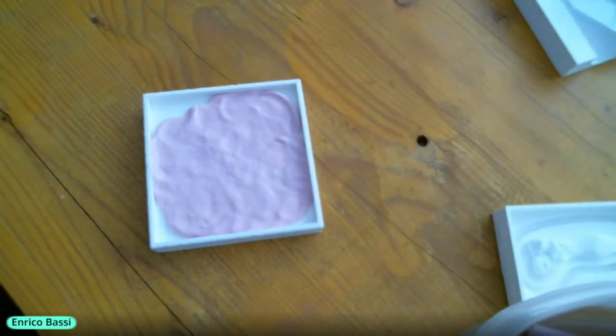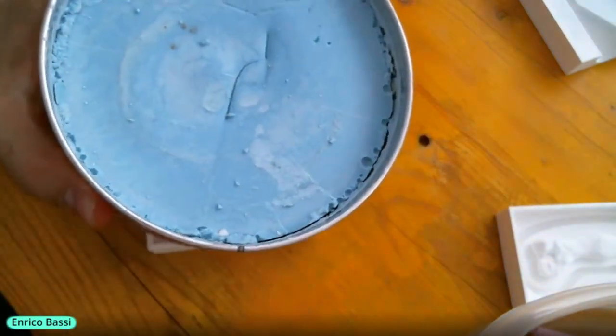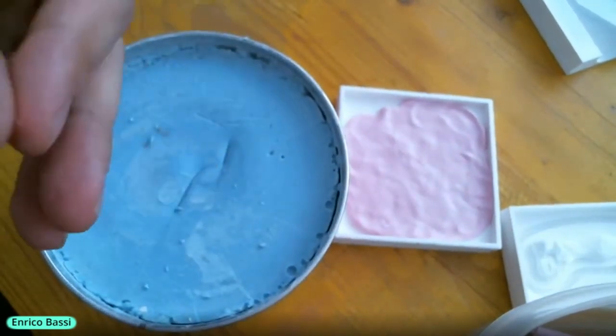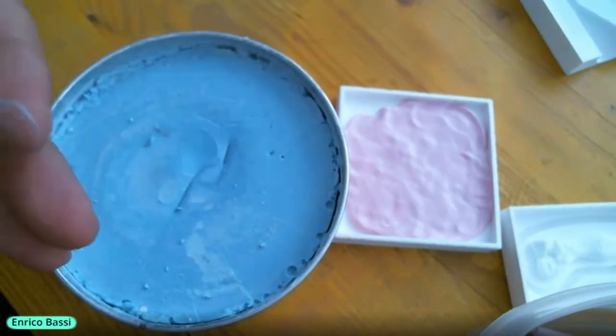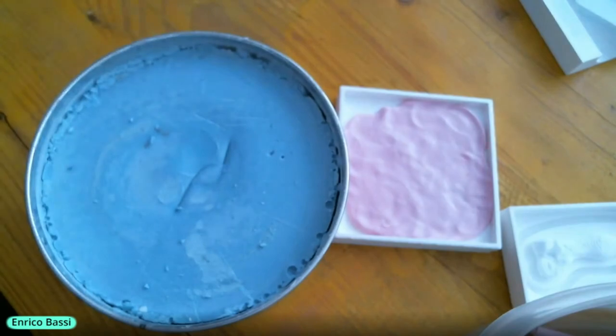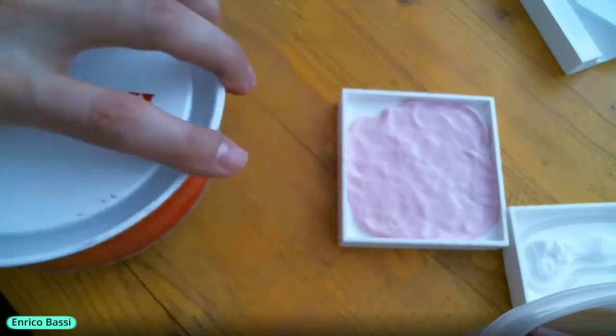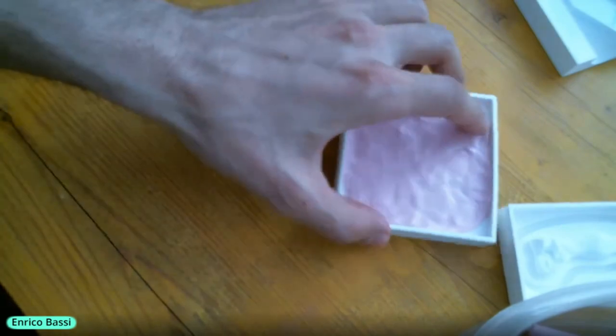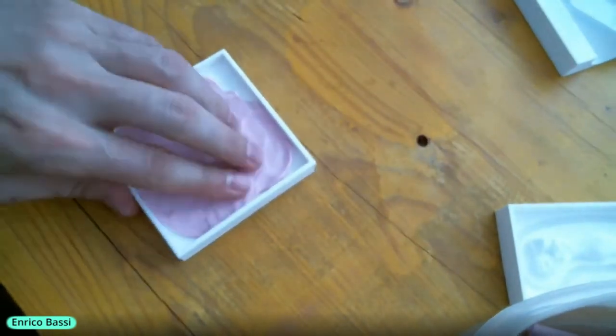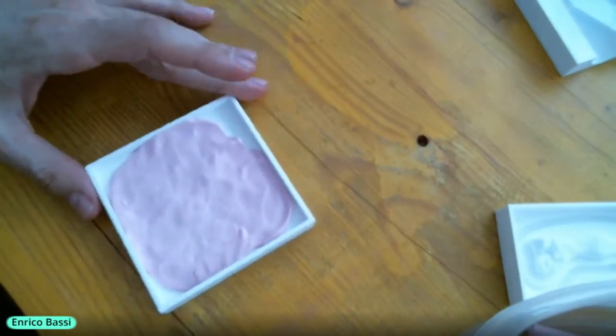It also depends on the material you want to cast, of course. Some materials are more sticky than others. So you see the thing looks like wax. So it is solid, but pretty oily. And this gives you something that you can easily spread on top of the surface of the mold. Again, important, for instance, when you make fibers, because you use materials that are meant to glue and get stuck quite easily on rubber or other simple material, is not a big deal.